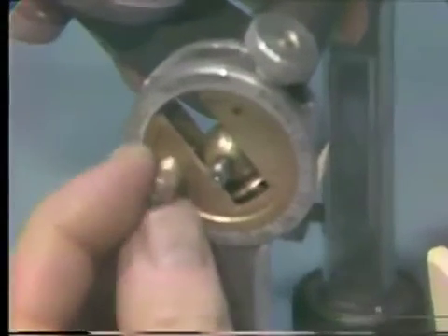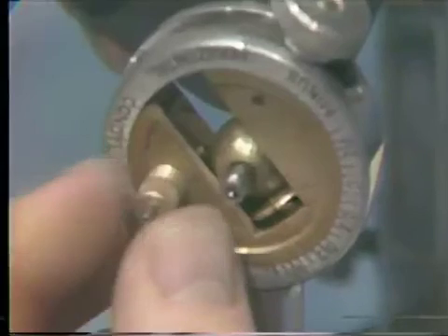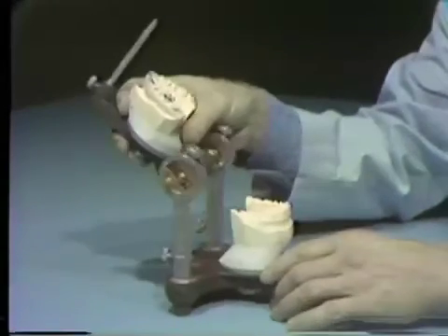When completed, the mandibular cast will now be positioned more posteriorly in relation to the maxillary cast.